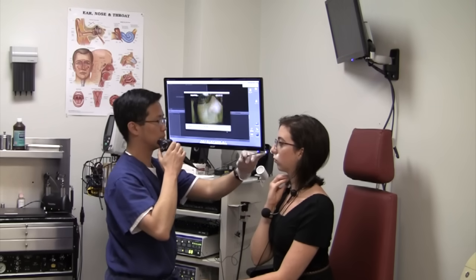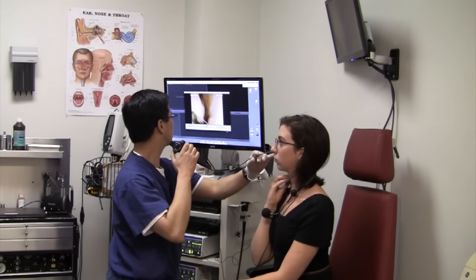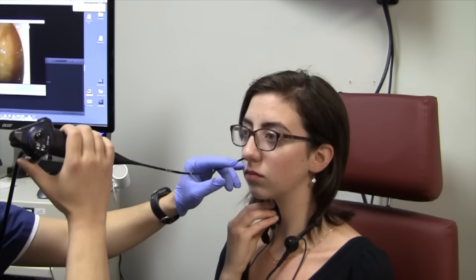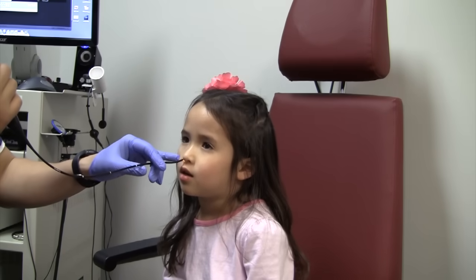After the nose is numbed and decongested with a nasal spray, a flexible endoscope can be threaded through the nose and into the throat in order to visualize the voice box. Both adults as well as kids can easily tolerate this procedure without sedation.